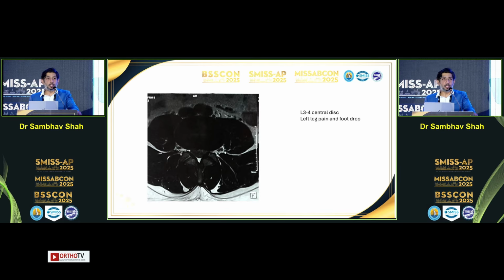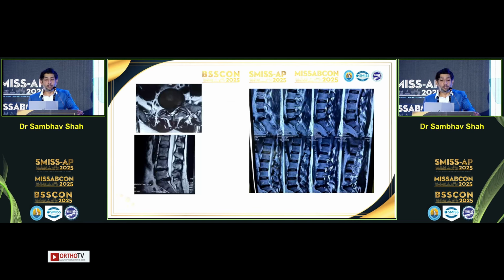Now, whether to use an interlaminar approach here, where I probably will need to remove bone, or should I go in transforaminal, which makes it the least invasive? So is there any way? In this module, we will discuss whether there are any algorithms available for us to decide whether we go for transforaminal or interlaminar. Similarly, you have an L5-S1 disc on the left side, a superiorly migrated disc. Again, the question is what approach to take.